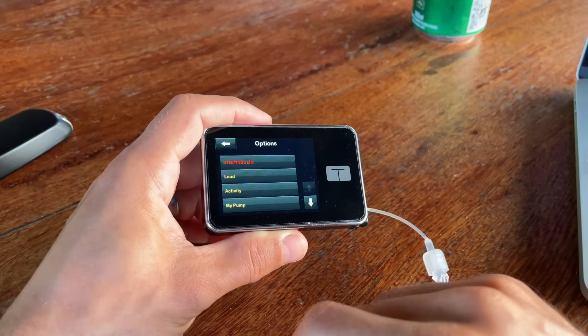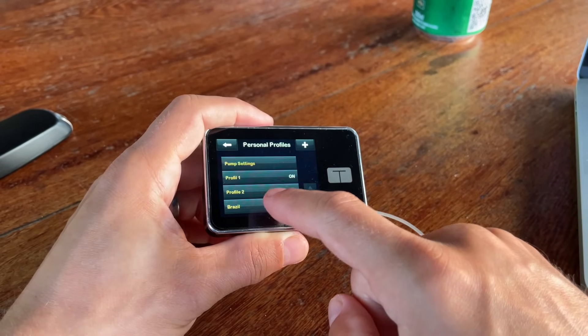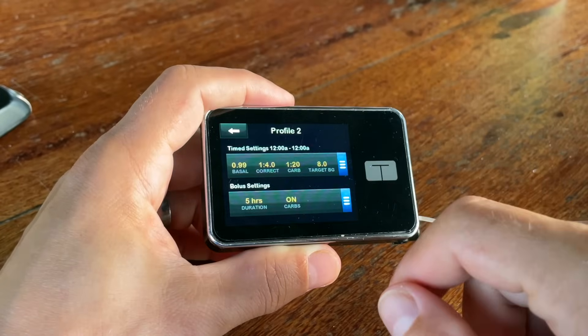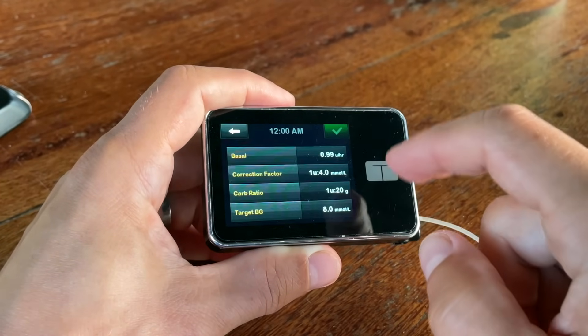What I find really amazing is that you can have up to six different personal profiles and switch between them whenever you want. For each profile you can set up completely different basal rates, insulin-to-carb ratios, and correction factors at specific times of day — super helpful for women who might have completely different insulin needs during their period versus a normal day, or for athletes with different needs on workout versus rest days.